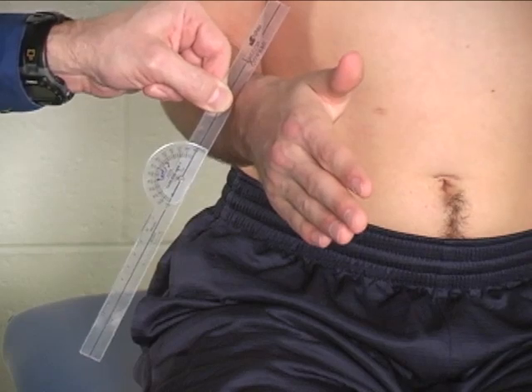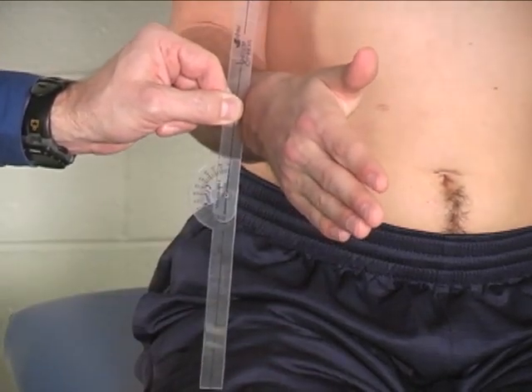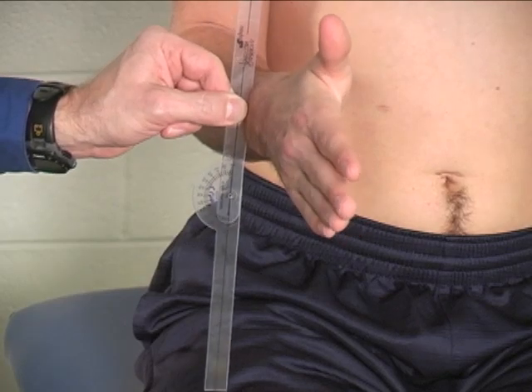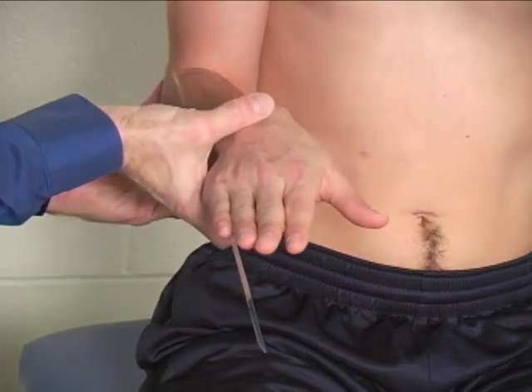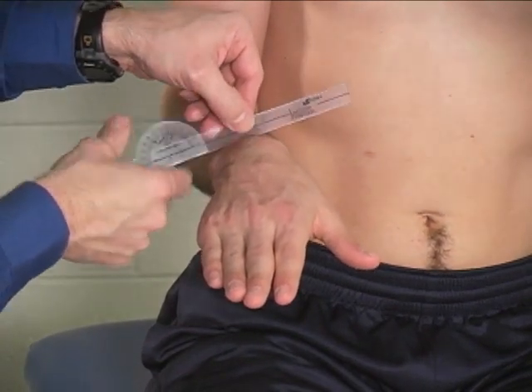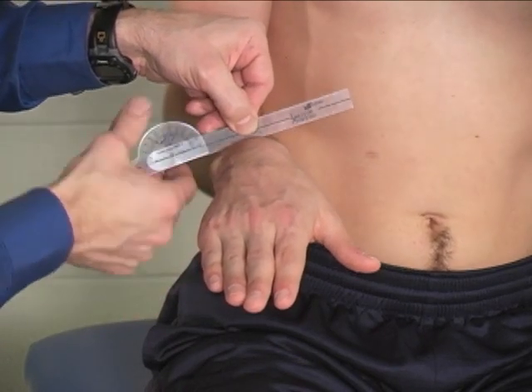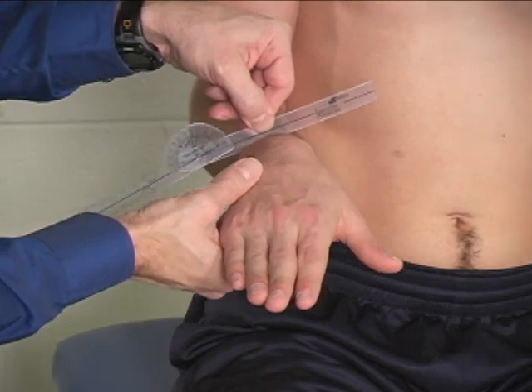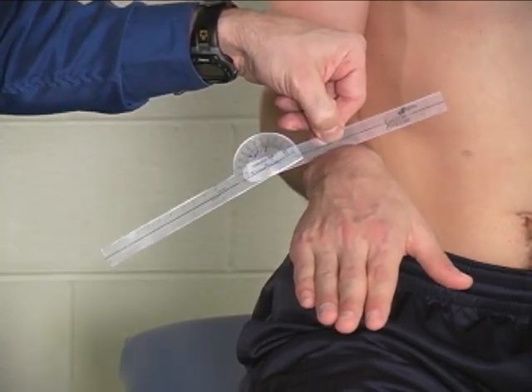You don't want it angled one way or the other — if you push it in there you'll feel it seat across both bones. That's the starting position. Then if you'll turn your hand palm down — let's keep you at about 90 degrees, that'll make it easier to see. Same sort of thing: on edge with the moving arm across both forearm bones just proximal to the ulnar head.